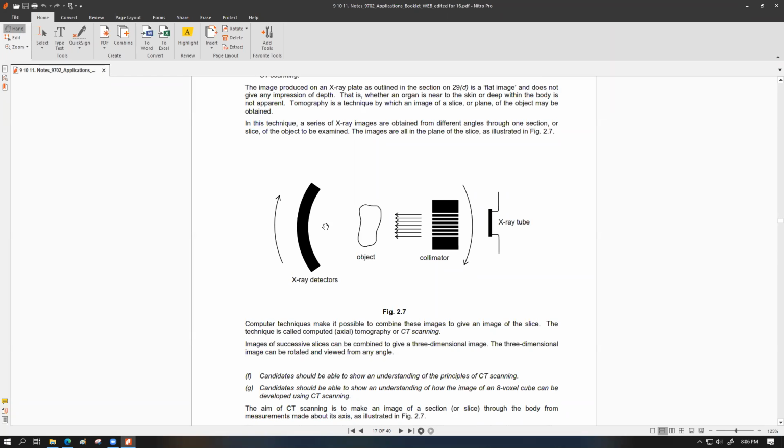How small that cube is going to be matters for how good a 3-dimensional scan image you can make. For example, let's say I'm trying to have a CT scan of myself. If the computer handling this information can only work with, let's say, 4 big chunks of voxel for my belly, think about it, let's say here is my belly, and then here are 4 voxels, like with a cross at the middle.